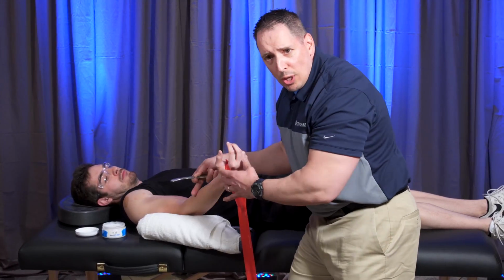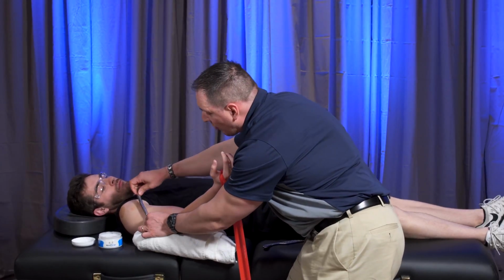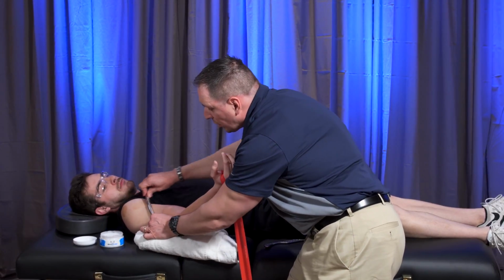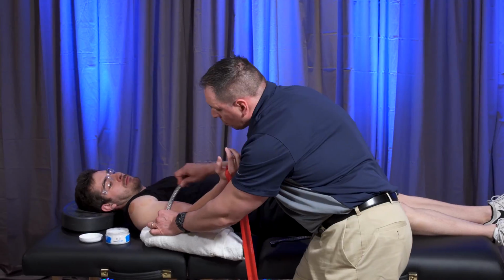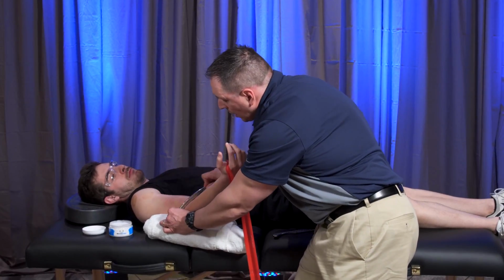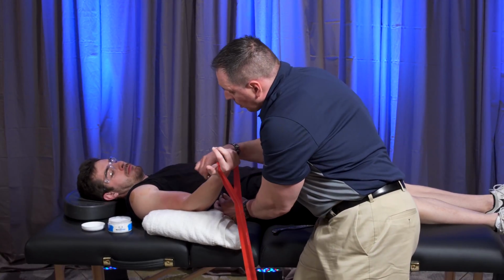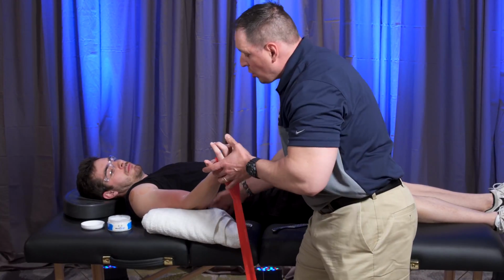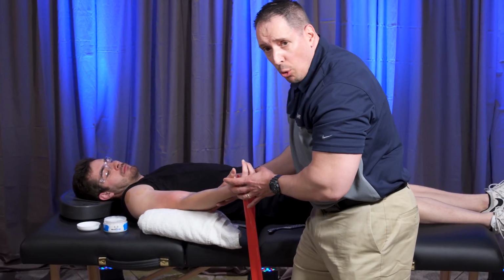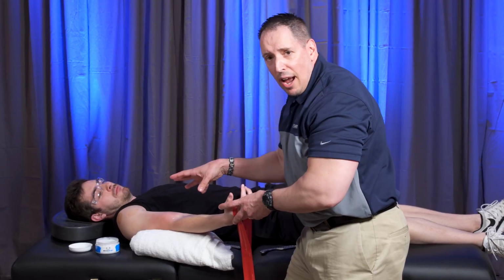Now if I find a particular restriction in one particular area, what I may do is go to a different technique, let's say a fanning technique, where I'm going to assess a particular soft tissue restriction. Okay, and then I can move down this whole anterior line and just switch sides if I'd like to and come along. So as that soft tissue relaxes and comes into more extension, we're able to release that tissue and begin to activate it afterwards.